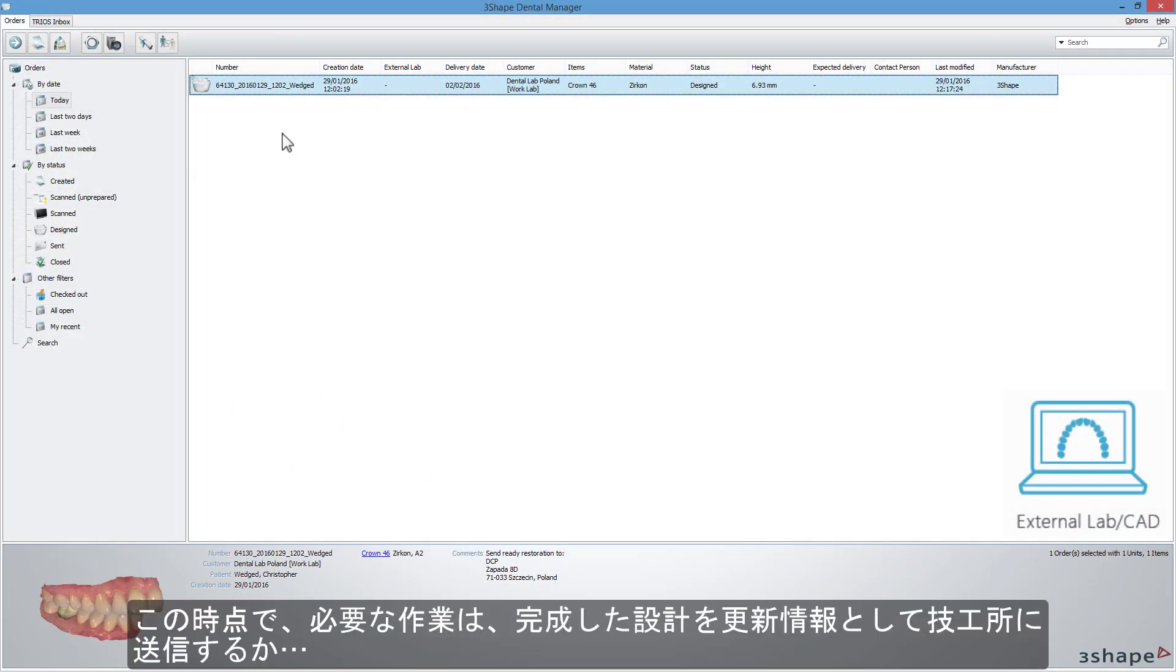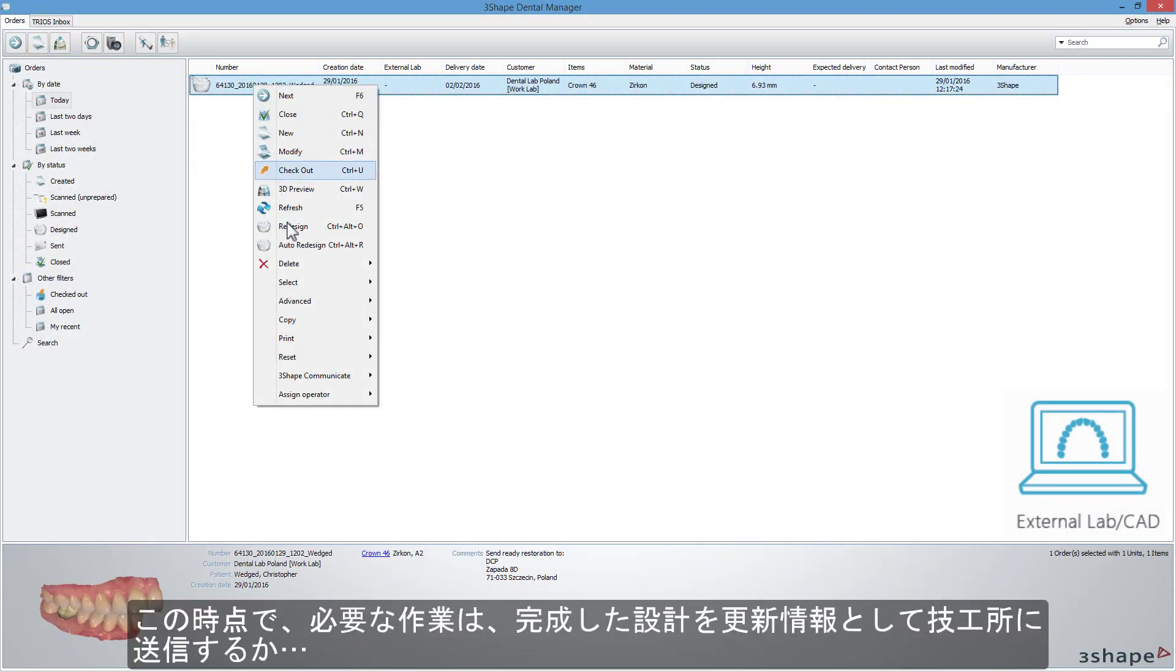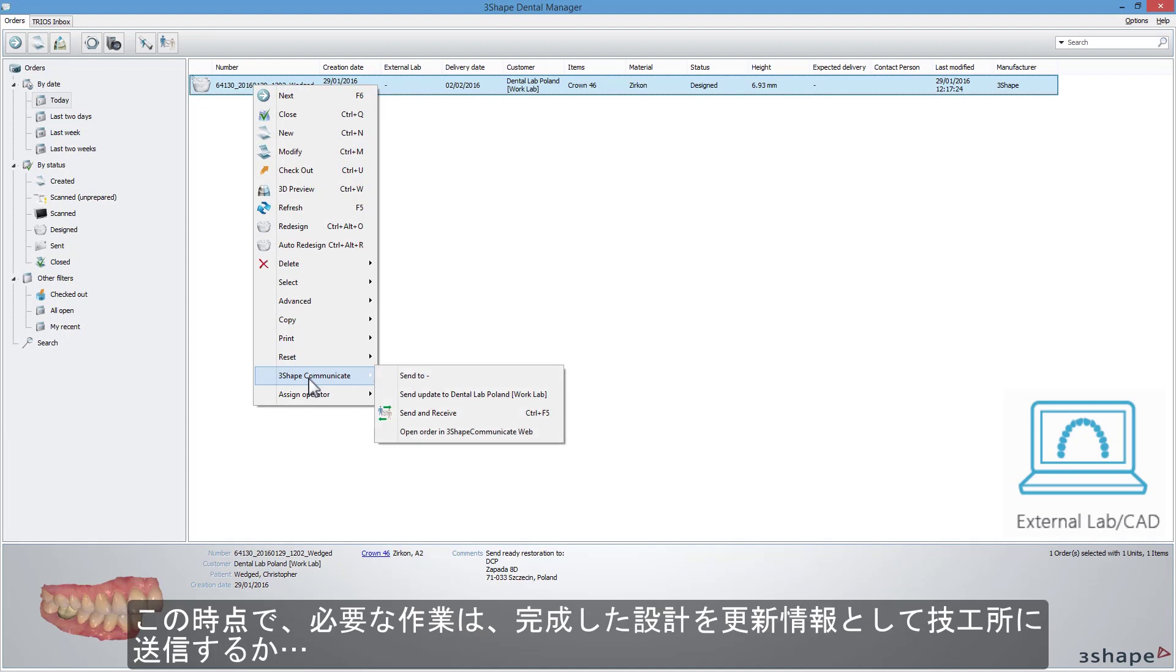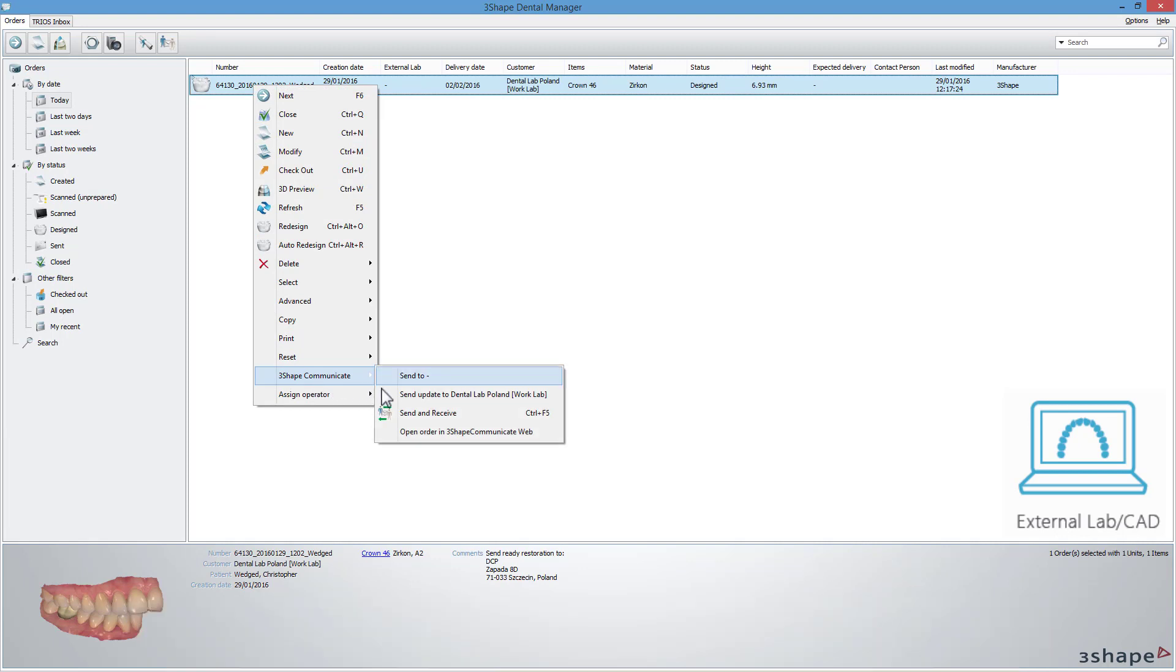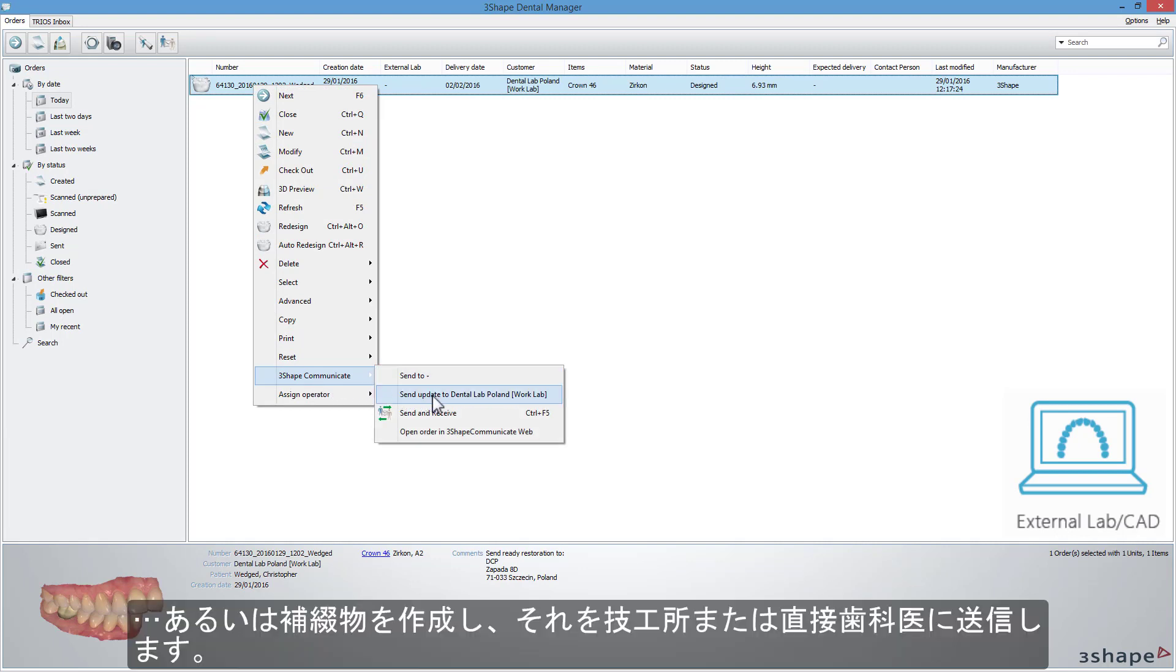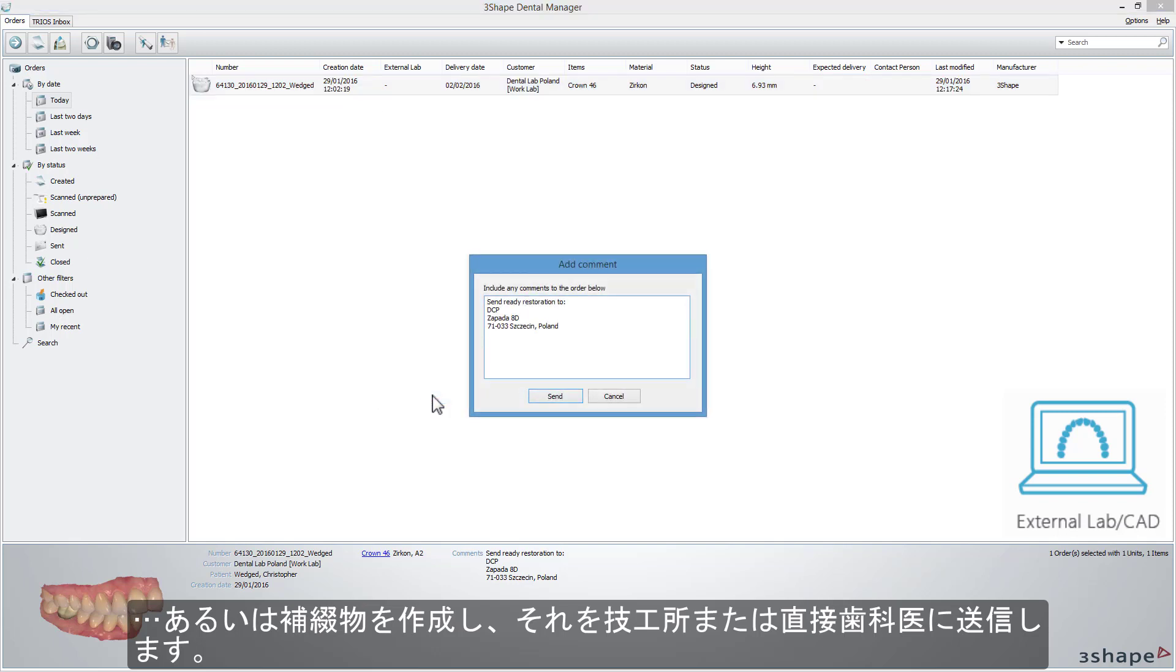At this point, all you need to do is either send the completed design as an update back to the lab or produce the restoration and send it to the lab or directly to the dentist.